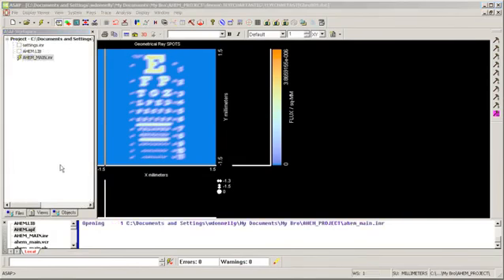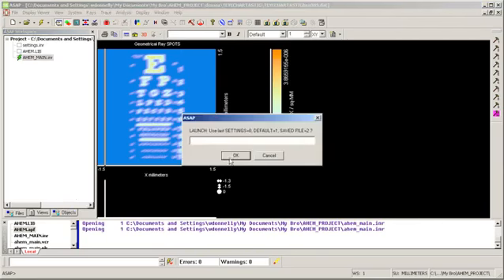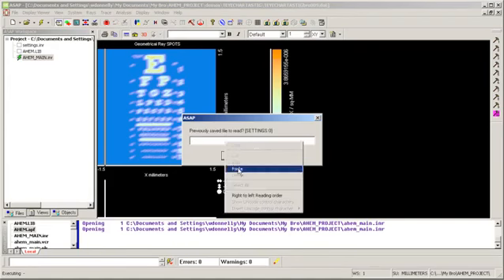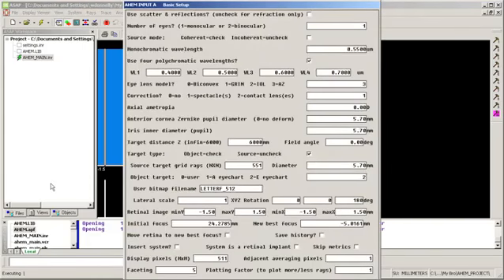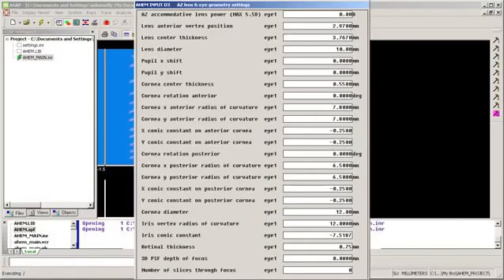All right, now I am reloading the settings for my corrected eye, which I corrected using optimization. So I'm going to start my model, and I'm going to paste in the name. Okay, so here's my first splash screen. Not much has changed, except now I'm going to do correction. So I've got a spectacle correction that I acquired. So I click OK. And my second screen, not much has changed here.